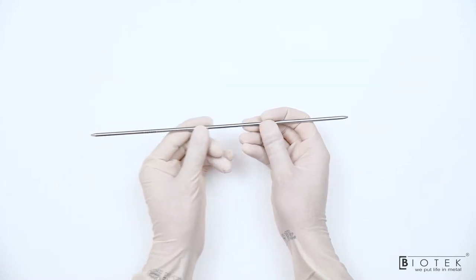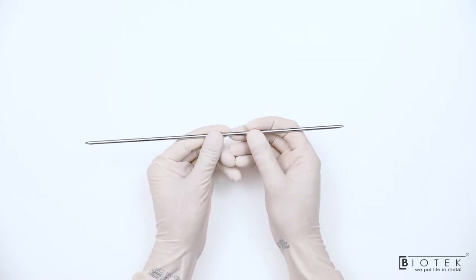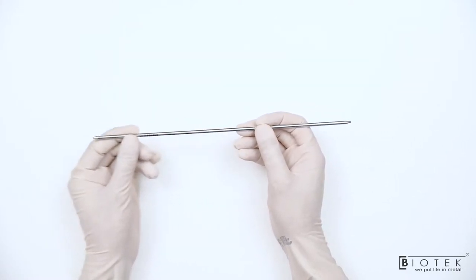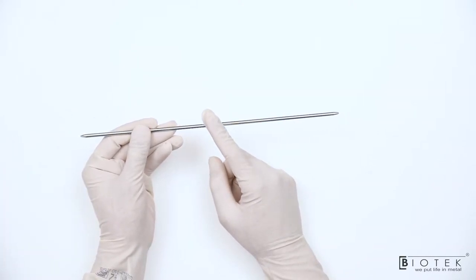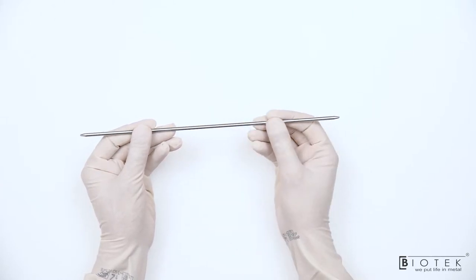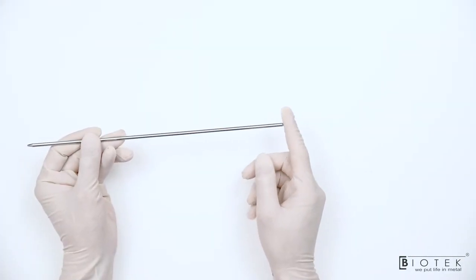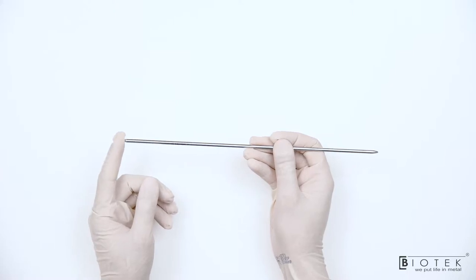This is known as Bissinger Rod. This is used to create arthroscopy portals and put a cannula over the Bissinger Rod. This is also used to switch the portals in between, so also known as the switching stick. The tip should be blunt so that it does not damage the soft tissue.